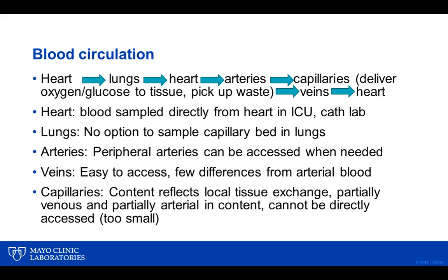We have a number of places we sample blood from. We sample blood from the heart, but mainly in the ICU and the cath lab, so our phlebotomists are not doing that, but there is the ability to sample blood directly from the right side of the heart or even the pulmonary arteries when that becomes relevant. As far as I know, there's no option of sampling blood from the capillary bed in the lungs. That might be interesting physiologically to understand partial pressure of oxygen in the capillaries of the lungs, but as far as I know, there's no option to sample blood from that compartment.